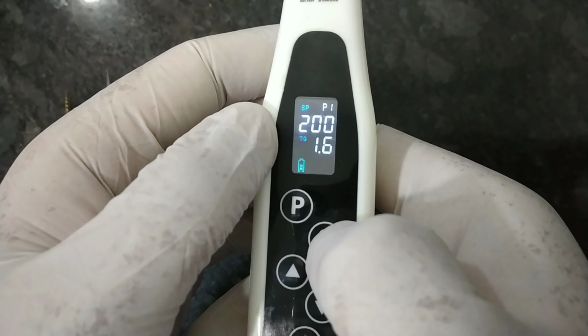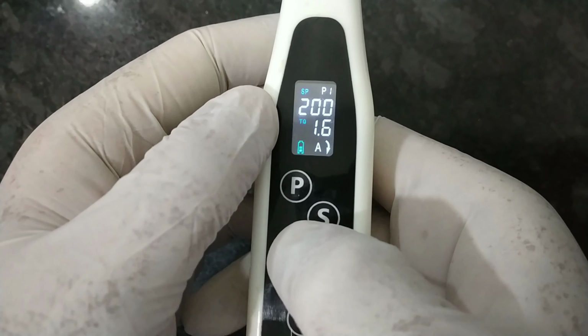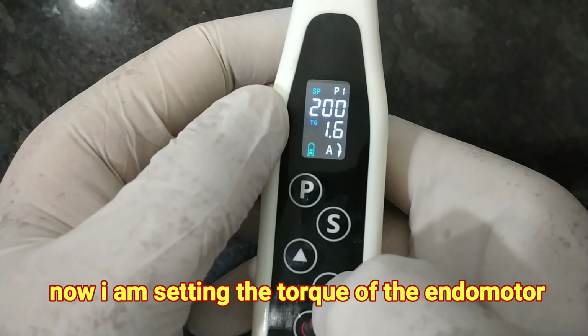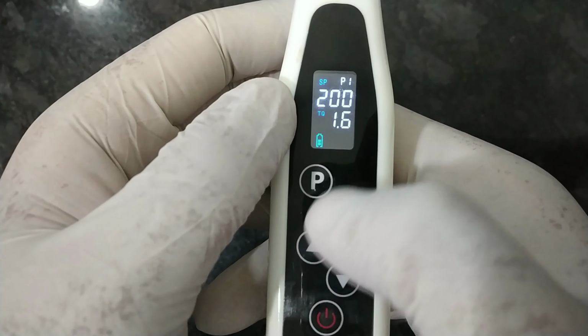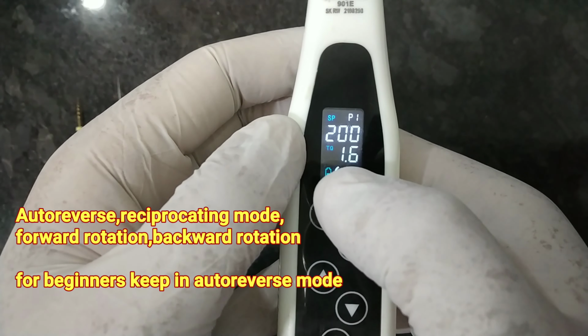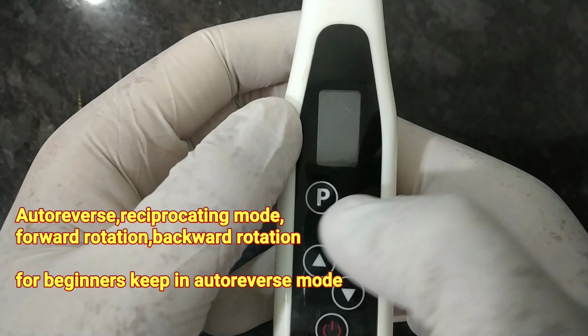Next I want to change the setting to which mode I want to keep it. So we can change the mode by again pressing this button. You can see the modes are changing. So this is the auto reverse mode, where the endomotor will automatically reverse when it gets any kind of obstruction. So this is set.